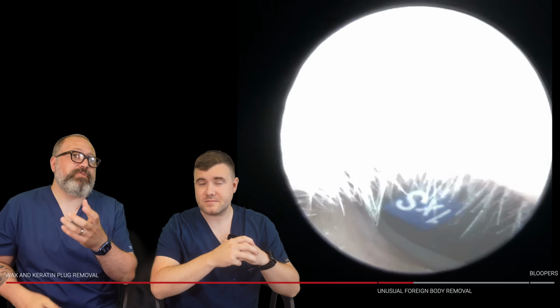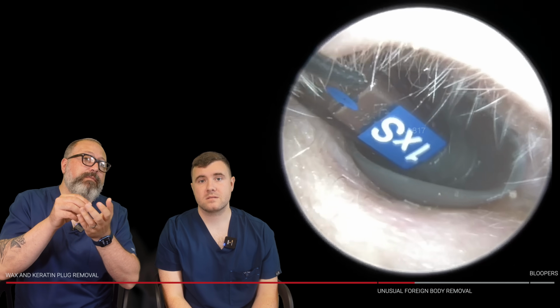Just so you guys know what a receiver is, when we talk about a receiver, it's part of a hearing aid, what they call a receiver in the canal hearing aid.